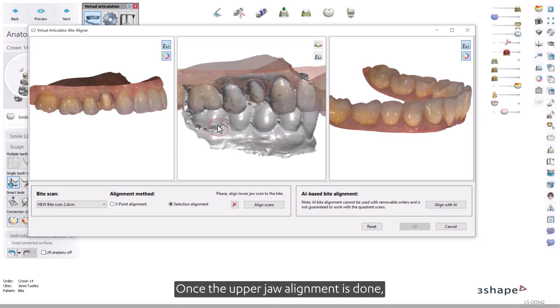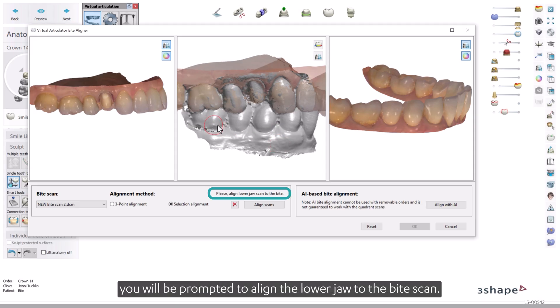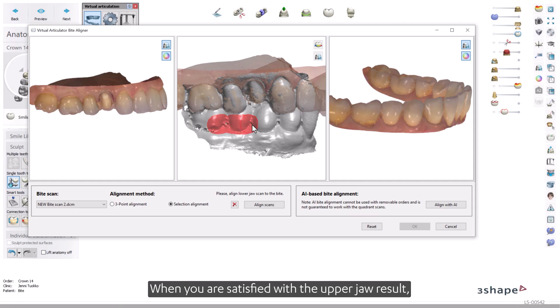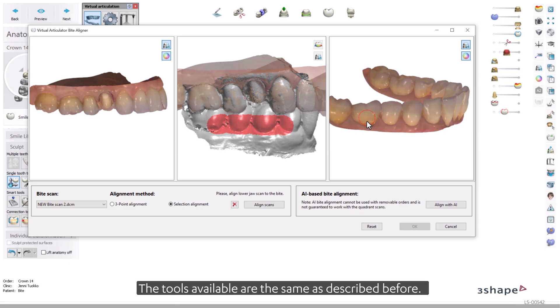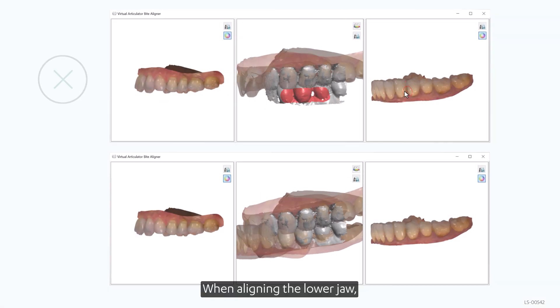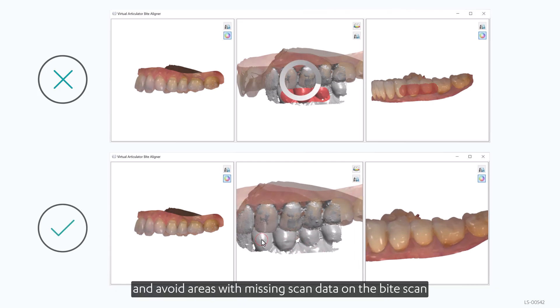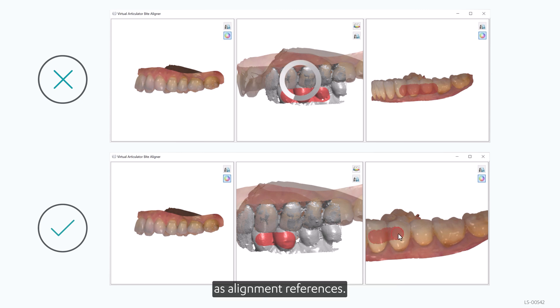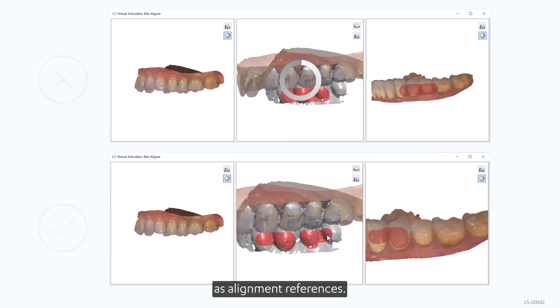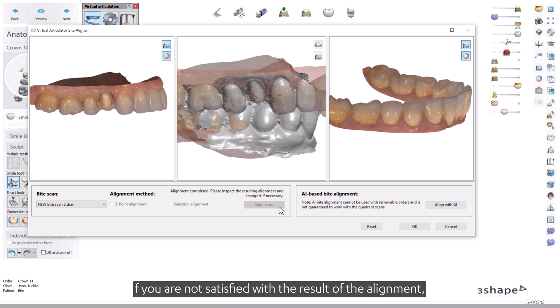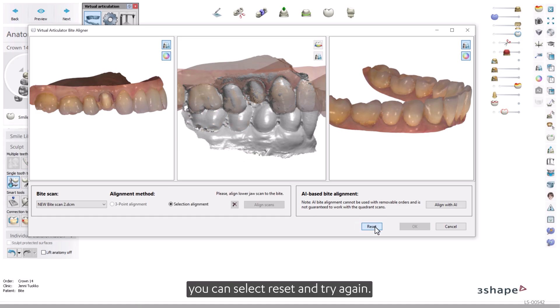The colors indicate the distance between the jaw and bite scans. Once the upper jaw alignment is done, you will be prompted to align the lower jaw to the bite scan. When you are satisfied with the upper jaw result, you can proceed to align the lower jaw. The tools available are the same as described before. When aligning the lower jaw, pay particular attention to only selecting lower jaw areas and avoid areas with missing scan data on the bite scan as alignment references. If you are not satisfied with the result, you can select Reset and try again.